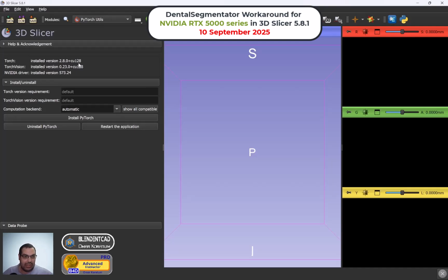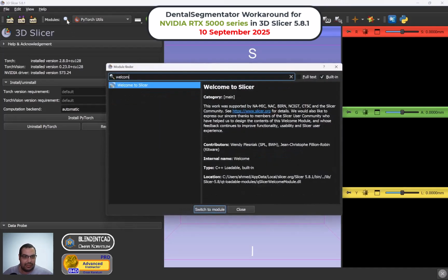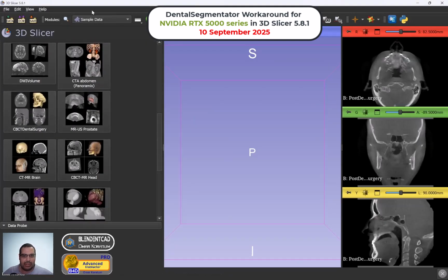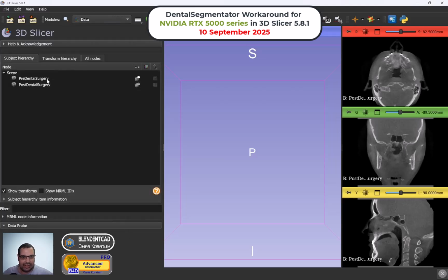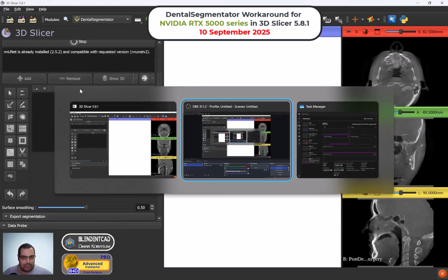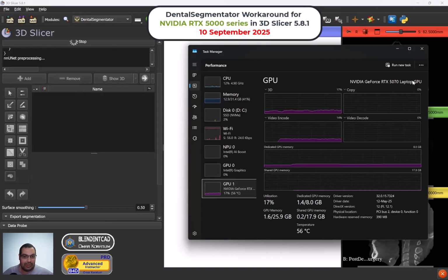Now we will go back to DentalSegmentator, and first we have to get the sample data or any DICOM file. So I'm going to the sample data again. I'm going to use the same sample data we used at the beginning of the video. I'll just delete this one, and then we will go back to DentalSegmentator, press on apply, and then I'm going to show you the performance of the new RTX 5070 graphics card. So now we have to wait a little bit. It's going to be a little bit faster, and it will finish the segmentation, not like before, which failed and didn't do the segmentation.